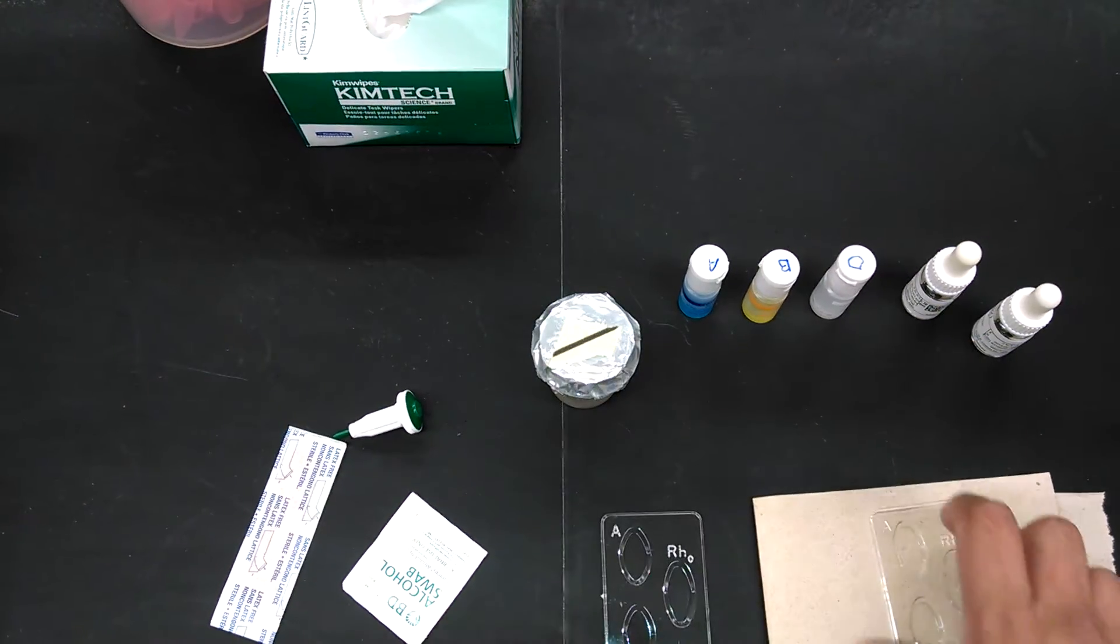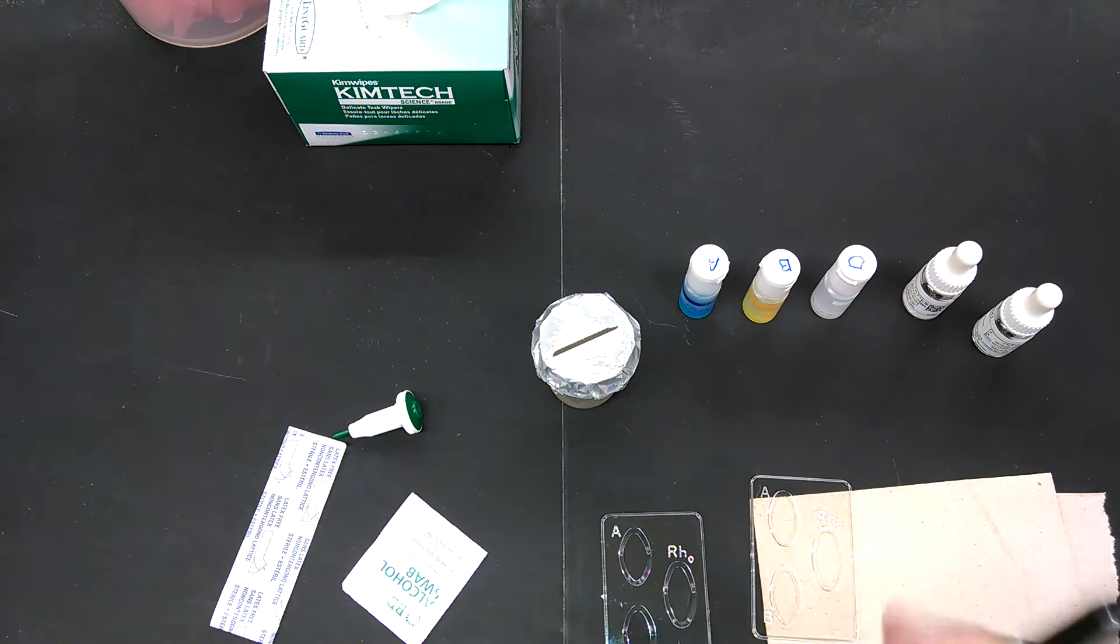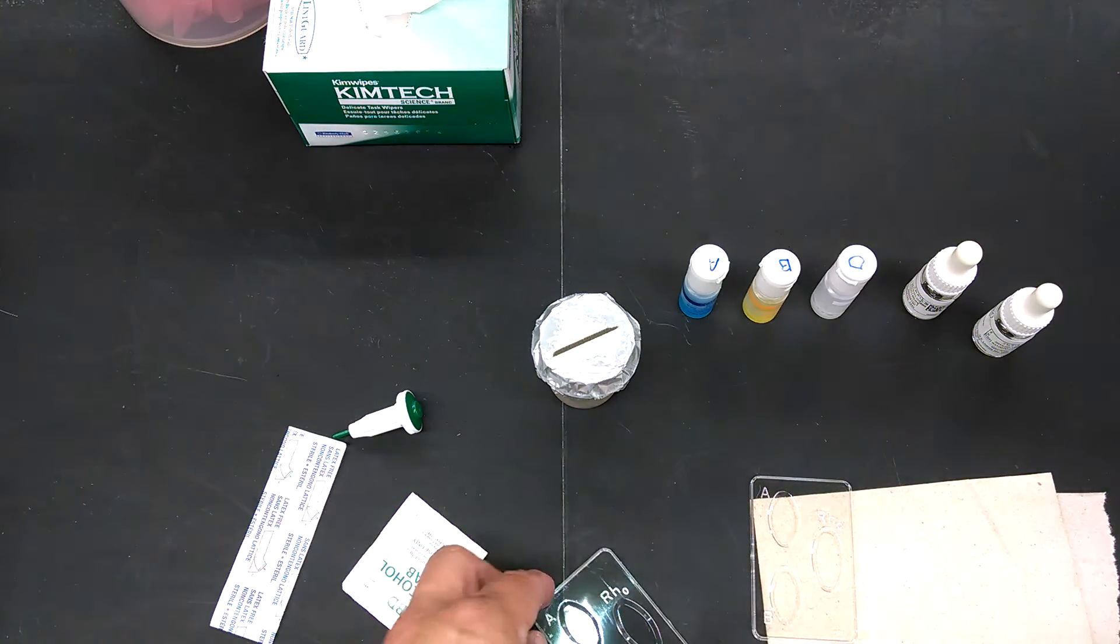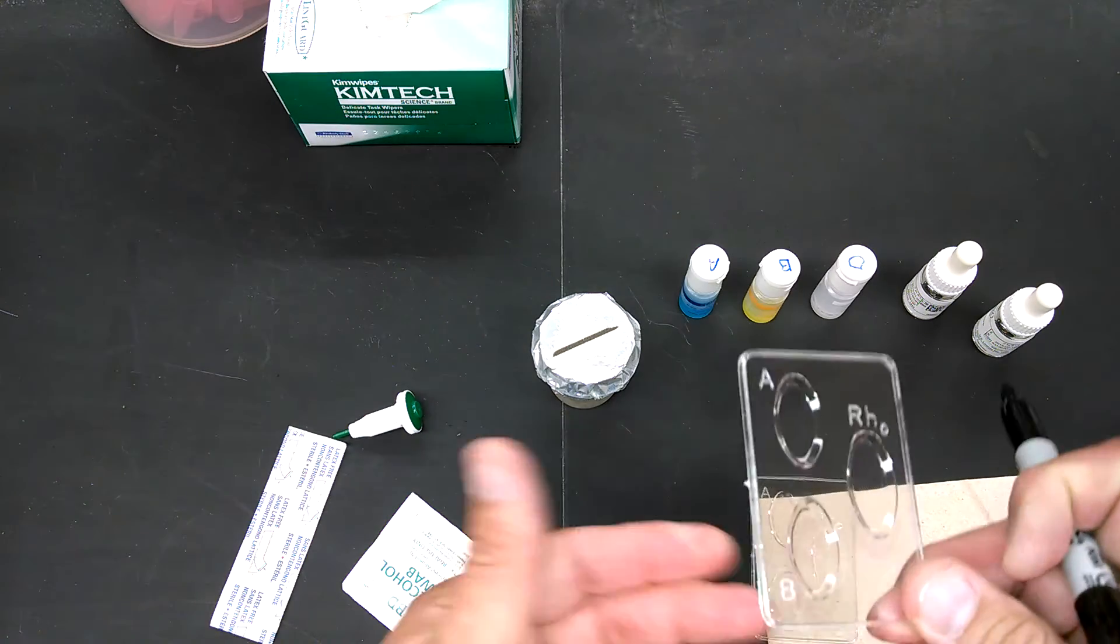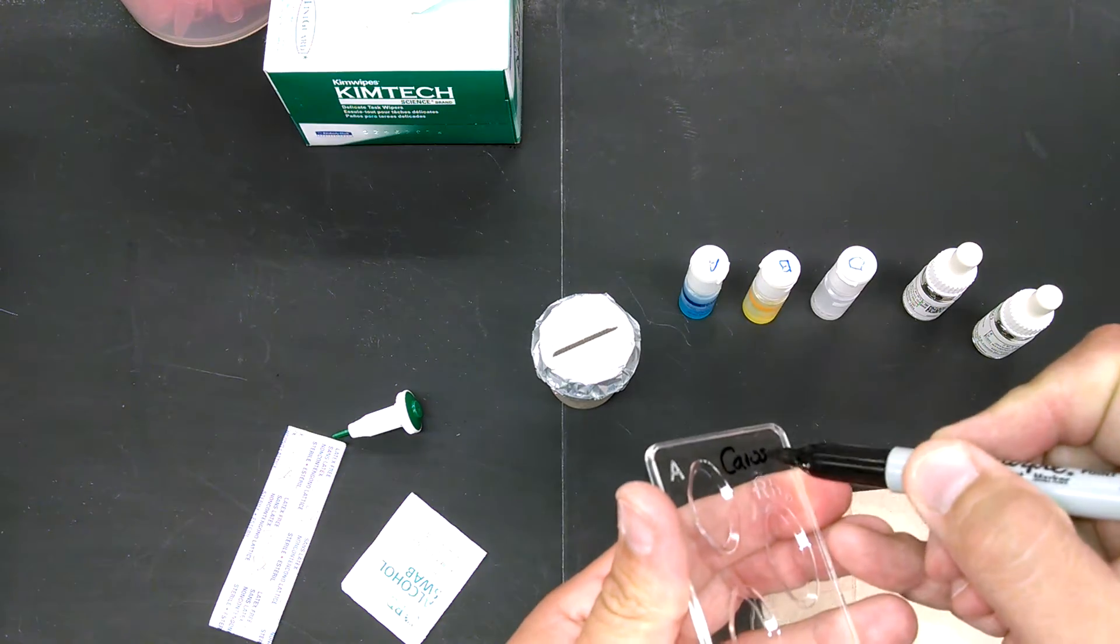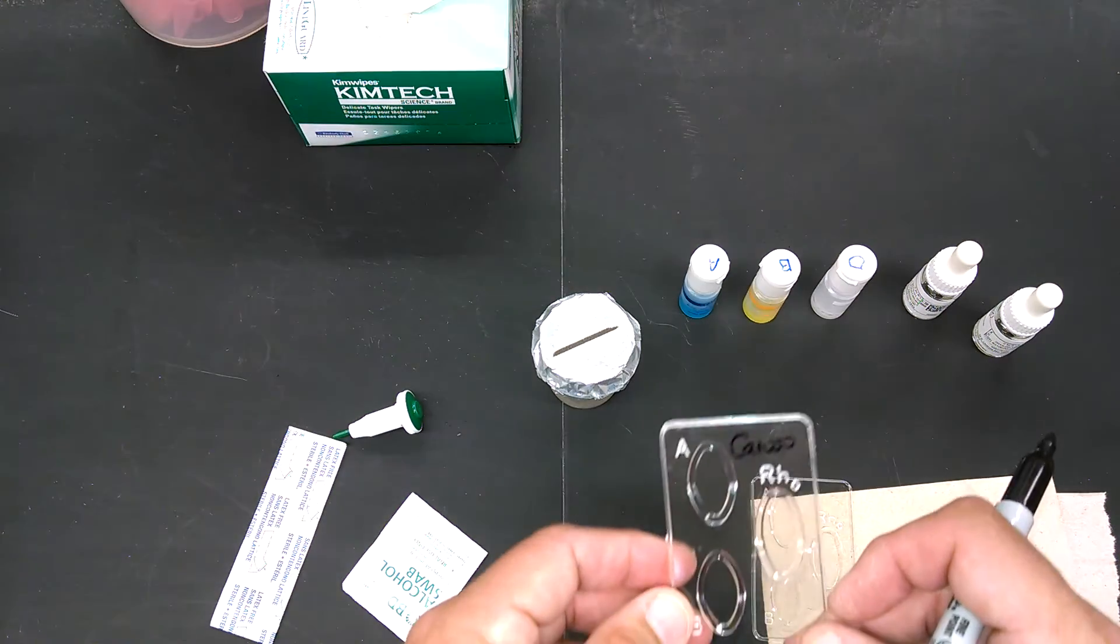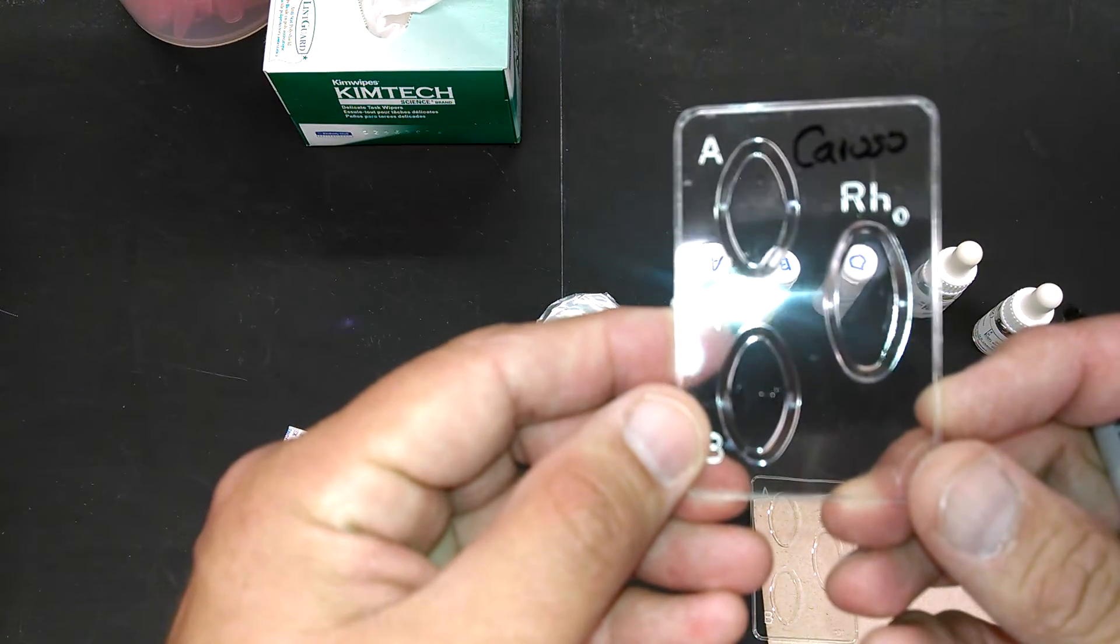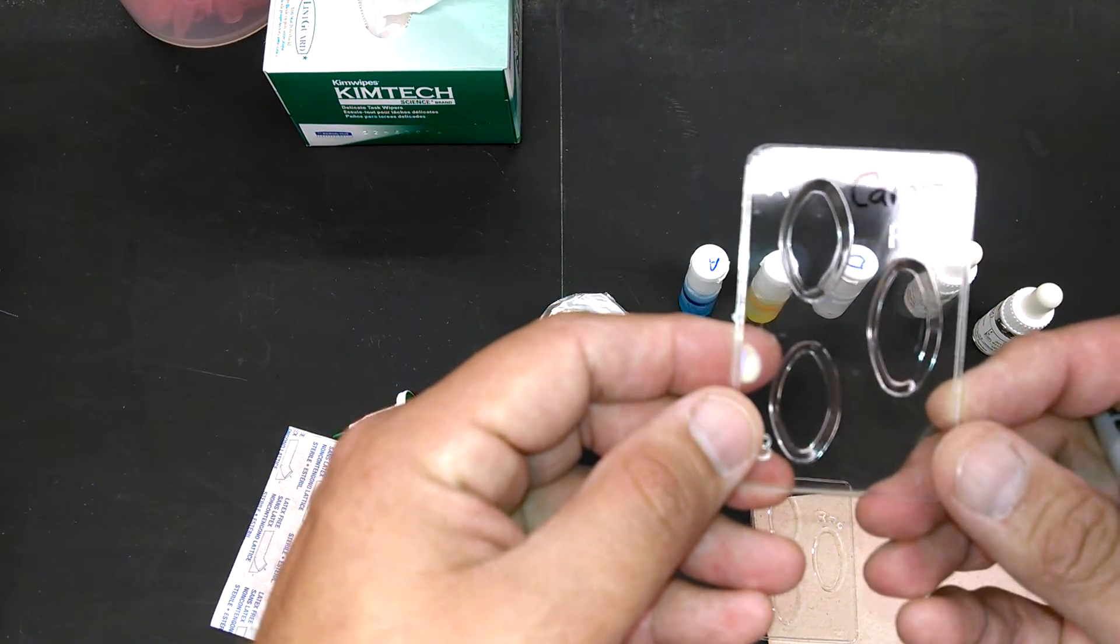You're going to want to do a little bit of prep work before you stab yourself with a lancet. Since everyone in the lab is going to be doing this at the same time, you want to label things. First, make sure your name is on the tray because some of these reactions take a little bit of time, and you may have to wait before you're able to see whether you're A, B, M, N, or MN.